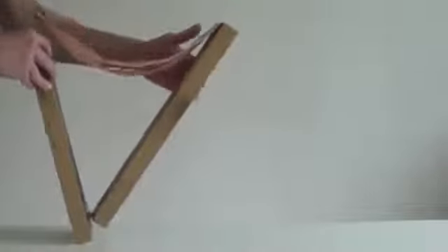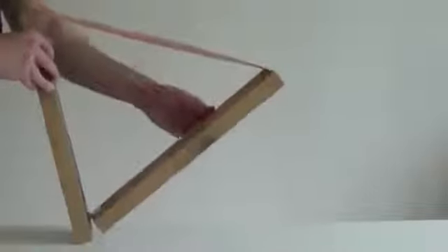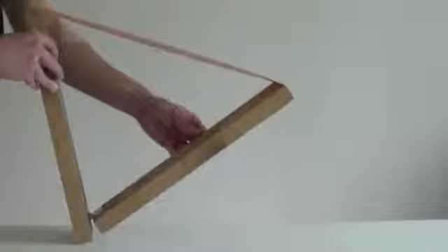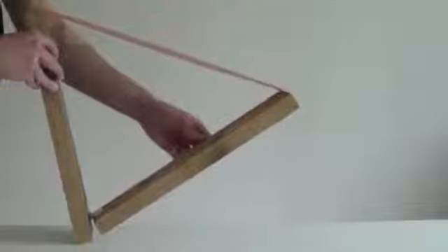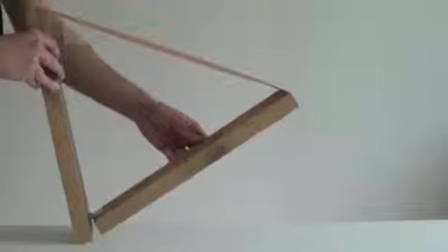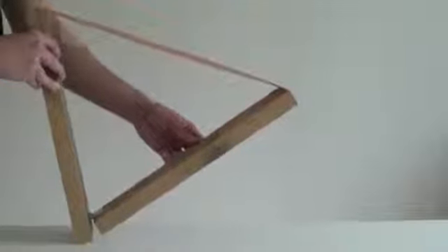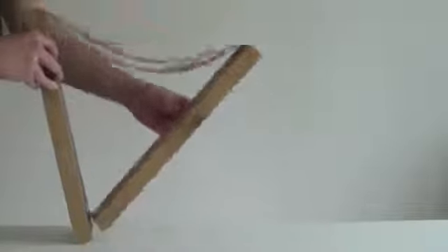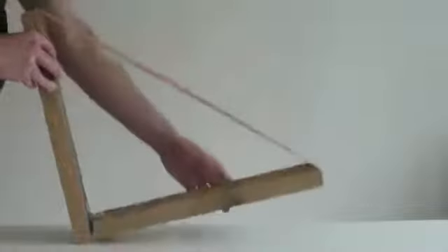This is a fundamental difference from some of your other taping techniques. The dynamic tape has been especially designed to allow it to be applied in a short position with stretch on it and still achieve full range of movement.